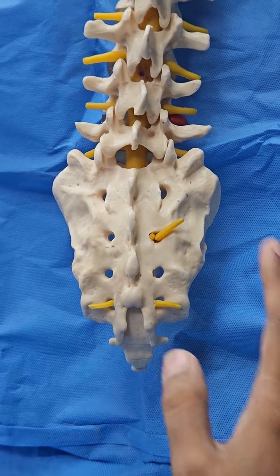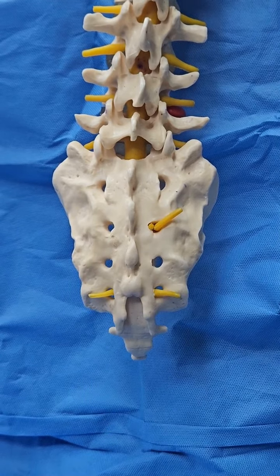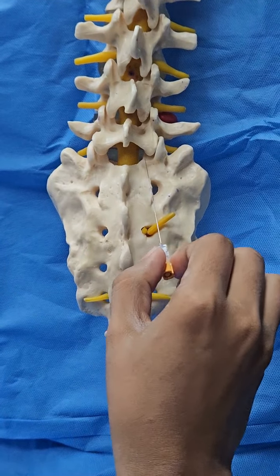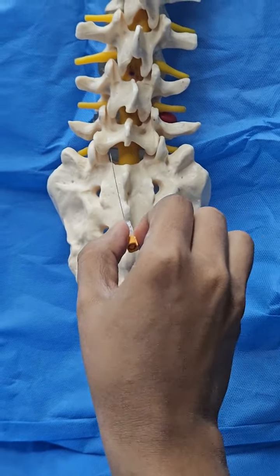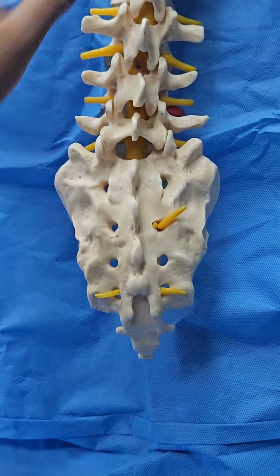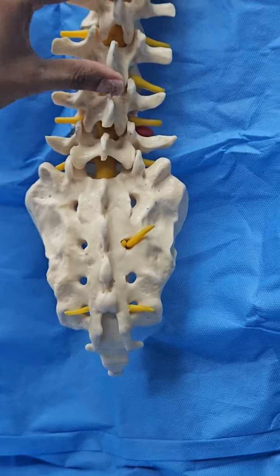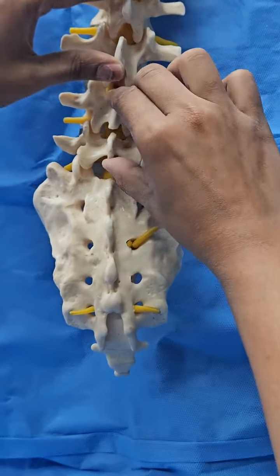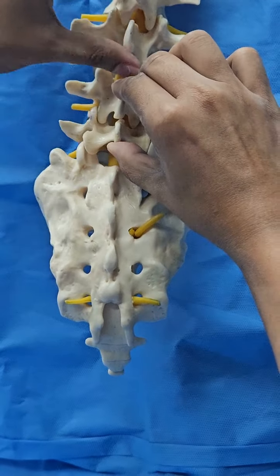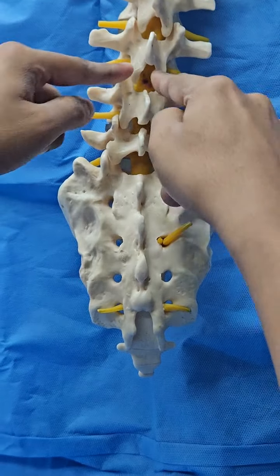The Taylor's approach for spinal anesthesia accesses the largest interspinal space, which is L5-S1. It is used in patients with ankylosing spondylitis, those who are not able to bend, where there is significant degeneration with little space in the upper levels, or where there is instrumentation and you cannot get in.